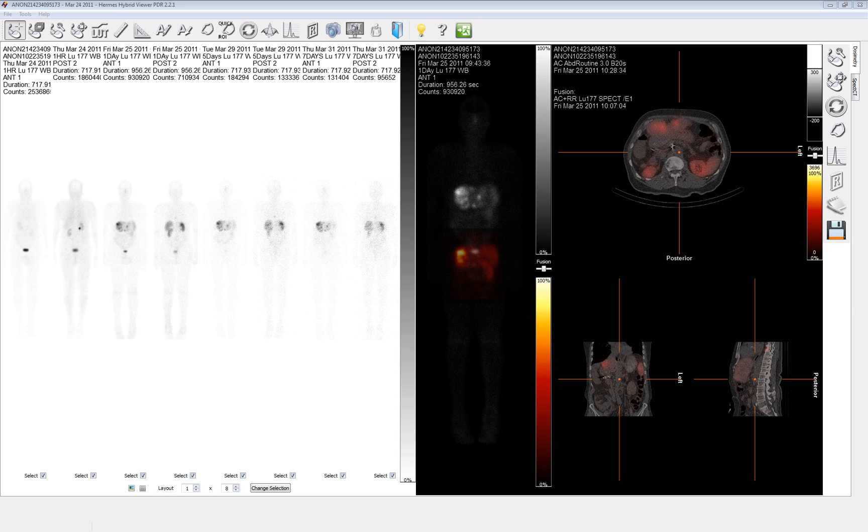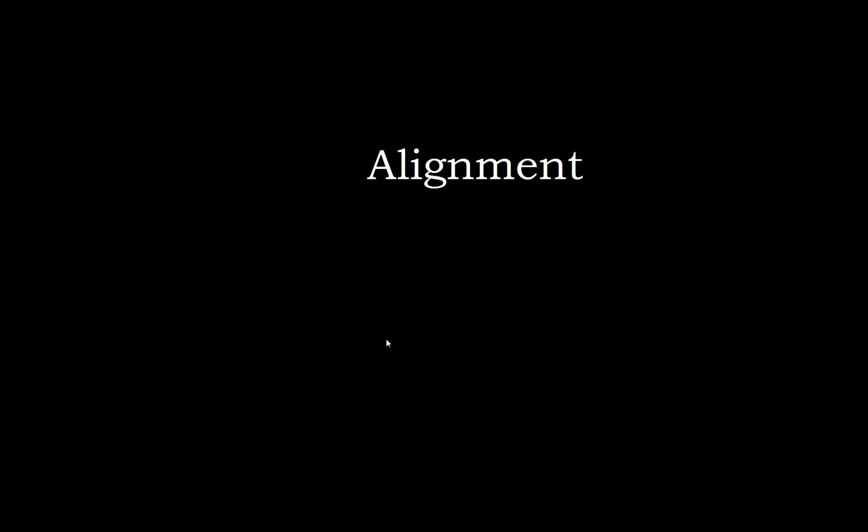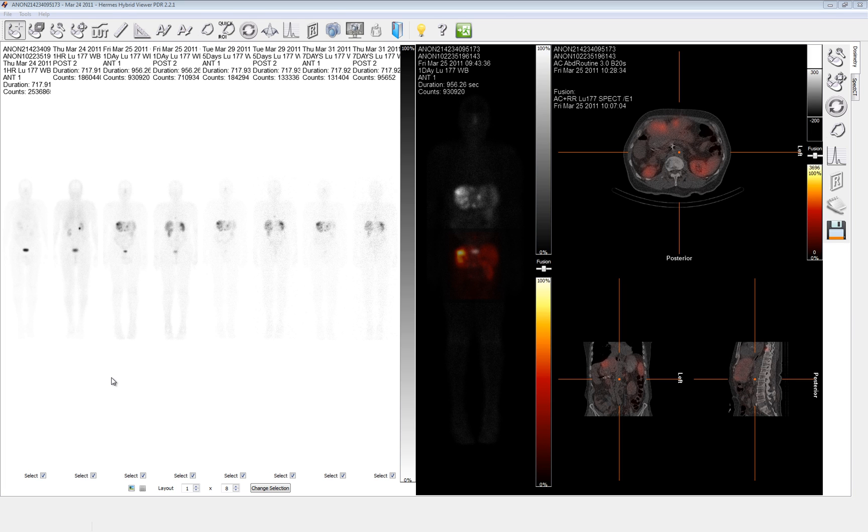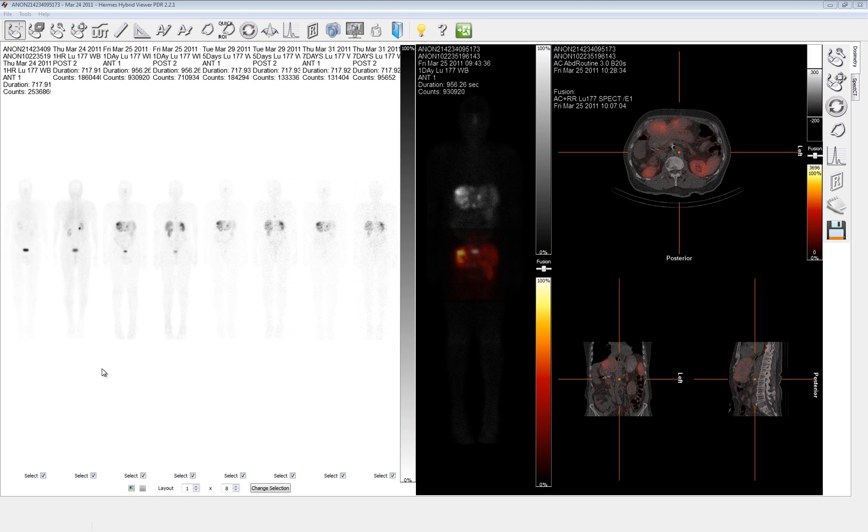The next thing we'll do is look at the first step, which will be Alignment. If there is a SPECT or SPECT CT loaded, then your first step is to align that SPECT with the whole body images. The program will automatically select the whole body image that is acquired at the closest time to the SPECT acquisition and display it along with the projection of the SPECT for the purpose of alignment.